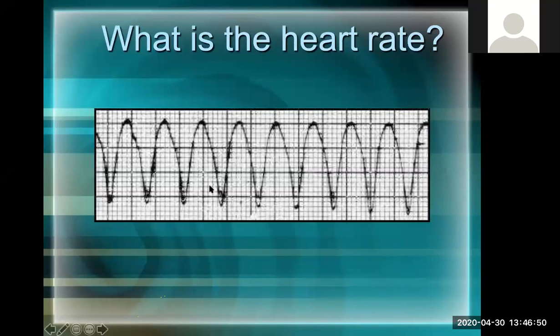Again, this patient has a tachycardia, wide complex, probably ventricular tachycardia. You can say this maybe 1.5, so 300 divided by 1.5 is 200. Or you can measure these tiny squares and then 1500 divided by the number of small squares.